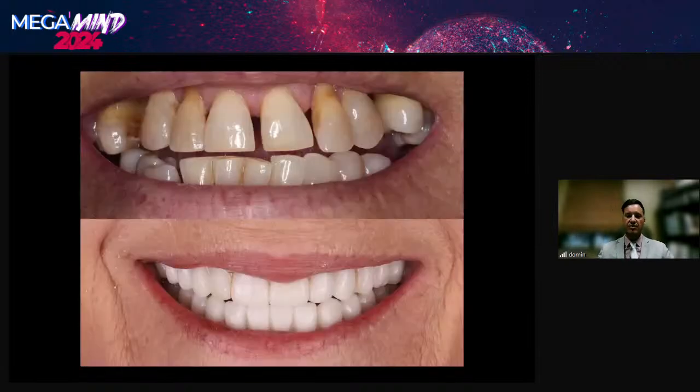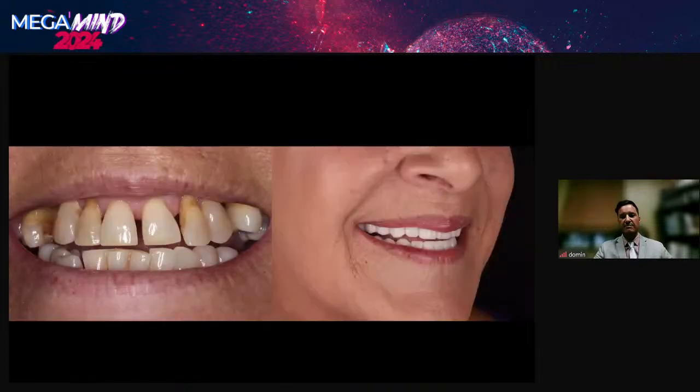So this is her before and after smile. The top photo is Monday. The bottom photo is Tuesday. These are 3D printed next day delivery full arch. And you kind of see that we give her back posterior teeth. We kept her in her correct CR position, got her into a correct VDO, and gave her a full complement of teeth, and actually completely changed the way she looks and gave her back her smile.